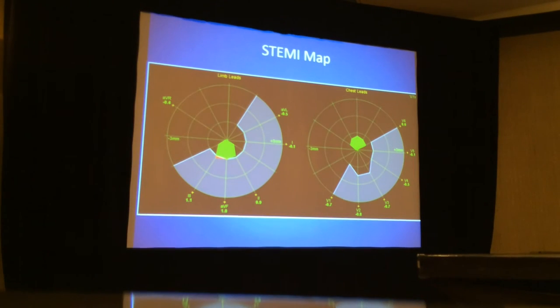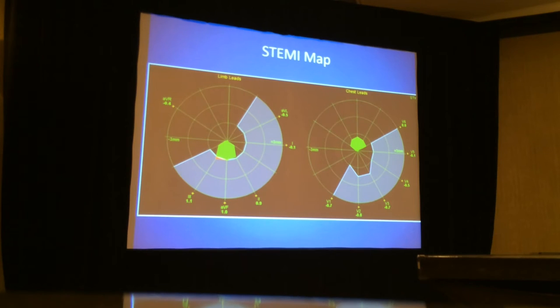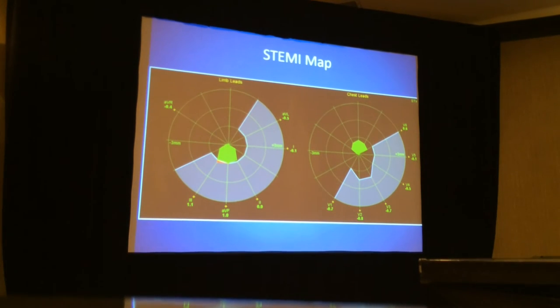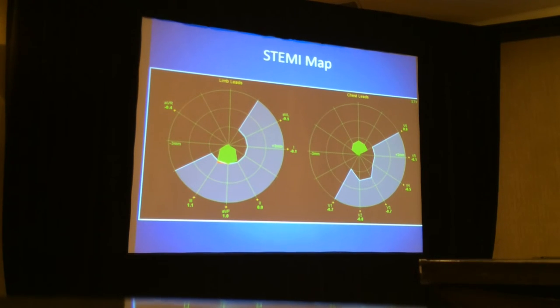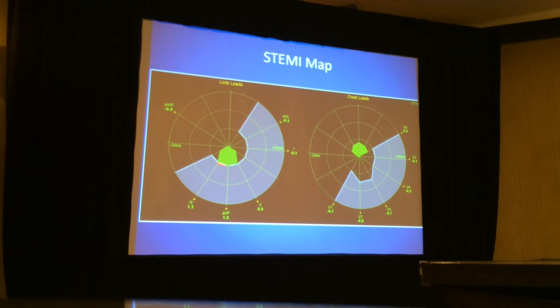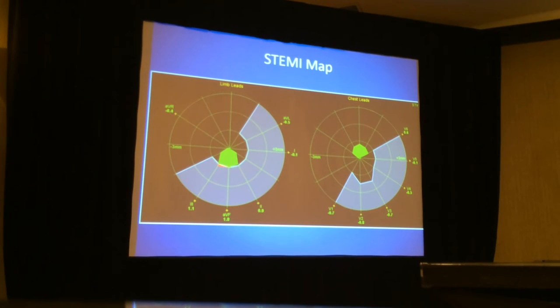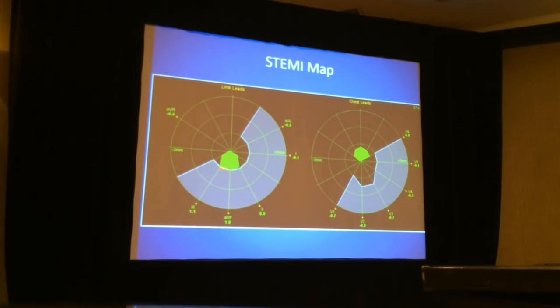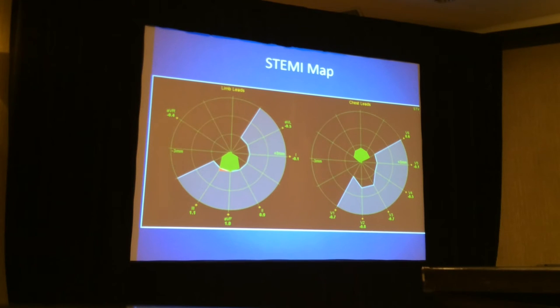And further he has produced an application called a STEMI map, which indicates the spatial regions in which ST segment deviation would produce what would be called ST elevation MI in both the frontal and the transverse plane. You can see that this particular patient would have STEMI criteria here, but since this is probably a right coronary occlusion with both inferior and posterior lateral involvement, the ST segment deviation in the transverse plane is away from those leads, and therefore would be seen as ST depression, and only seen as elevation if one considers a negative view. But this is the ST map image.